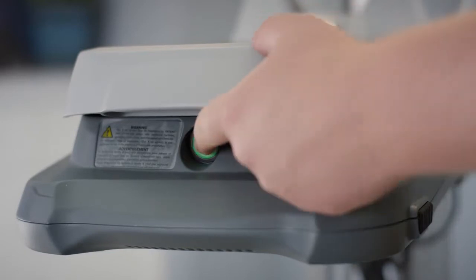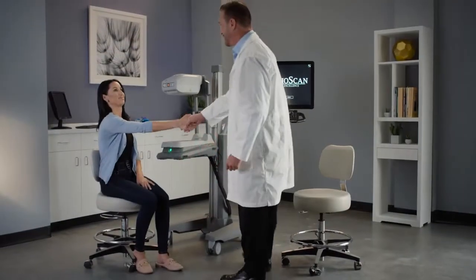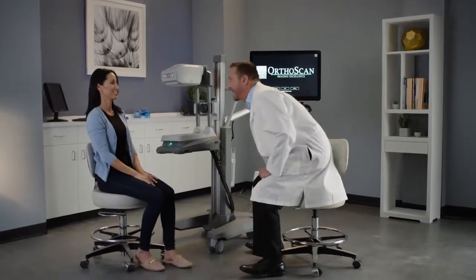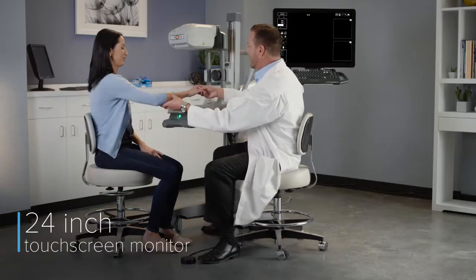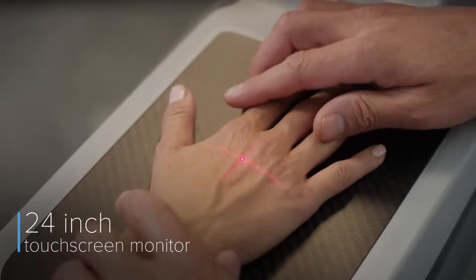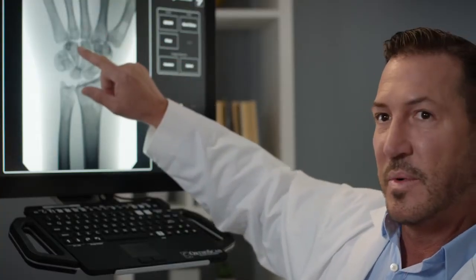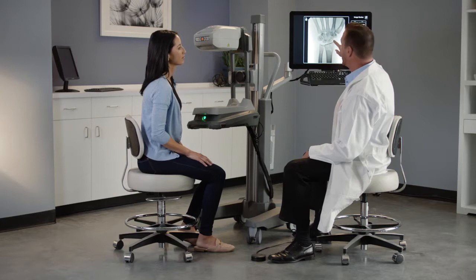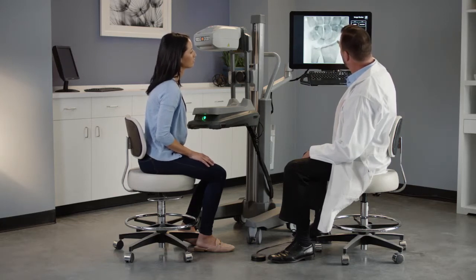Simply press the power button on the front of the device to begin. Mobile DI is a one-of-a-kind mini C-arm designed specifically for the clinical setting. With the high-definition 24-inch touchscreen monitor, patients and physicians can view anatomy in real-time, improving patient satisfaction and clinic workflow.